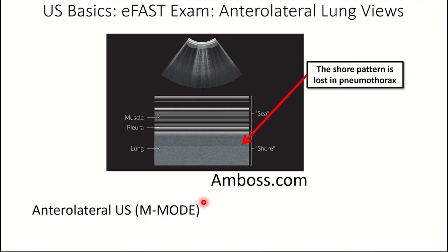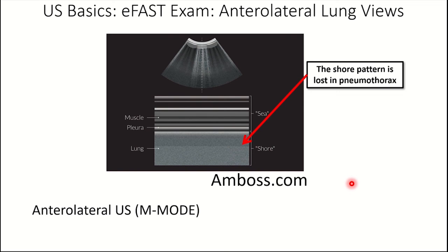That was all in B mode. Now we move to M mode — motion mode ultrasound. The parietal pleura and structures superficial to it, like skin and muscle, are stationary and appear as parallel lines of varying echogenicity. Here's the muscle, skin, pleura, and then lung. The visceral pleura and underlying lung move with respiration and appear grainy on M mode — a granular, TV static appearance resembling sand on the shore, while the parallel lines represent sea waves. This seashore appearance is normal.